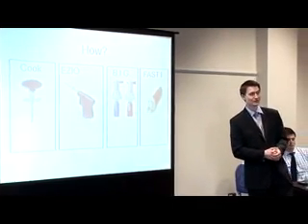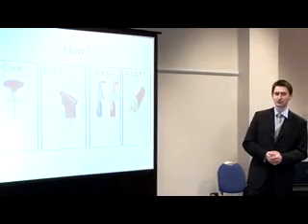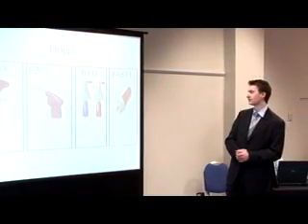The FAST-1 is the one that the military often use. It was used at the Beijing Olympics, apparently. Don't have a vasovagal at the next Olympics in London.